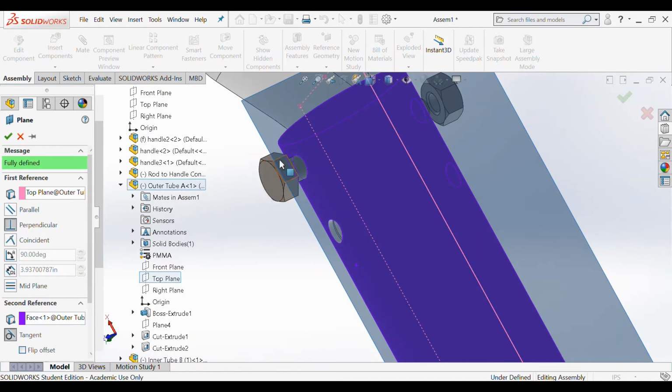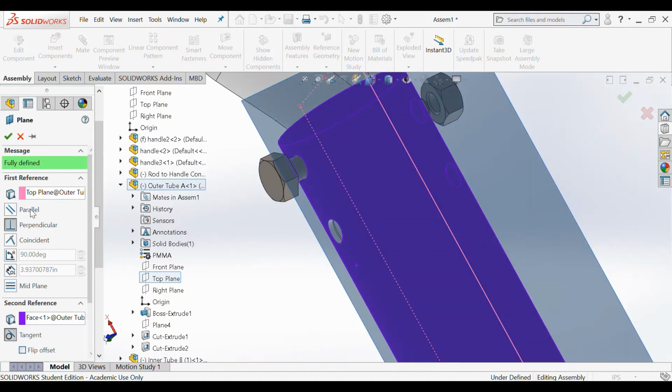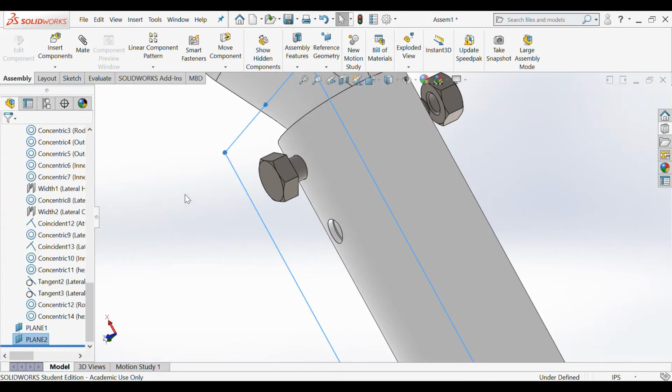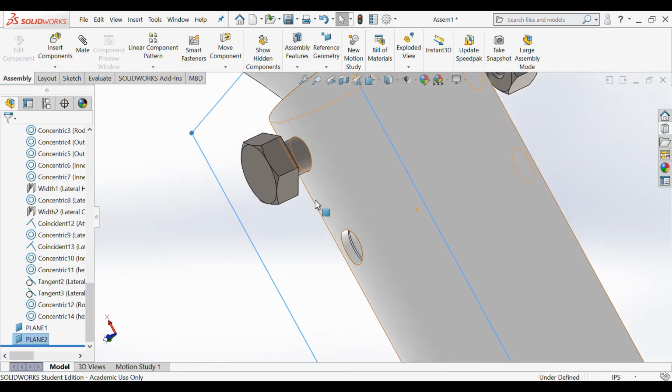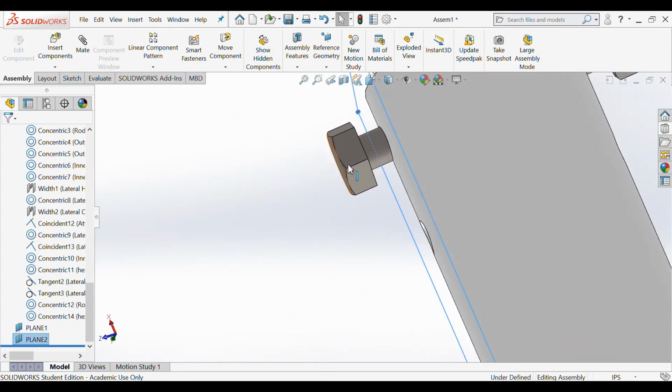And the second reference, I'm going to go ahead and click this. And what I want is a plane that is parallel to the surface of the bolt. So what I'm going to do is flip the offset and make it parallel versus perpendicular to the first plane. So I'm going to click that green check mark. And now, as you can see, this plane right here is tangent to the surface of the outer rod and parallel to the surface of this bolt.